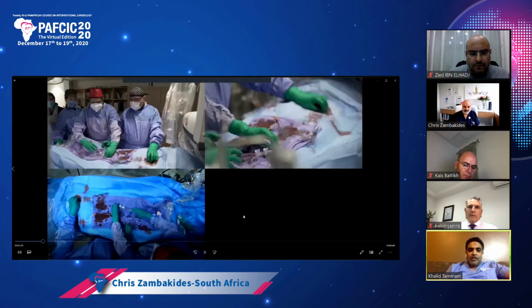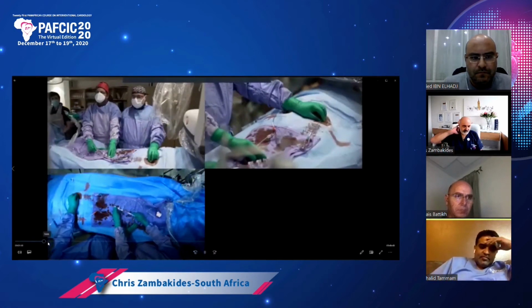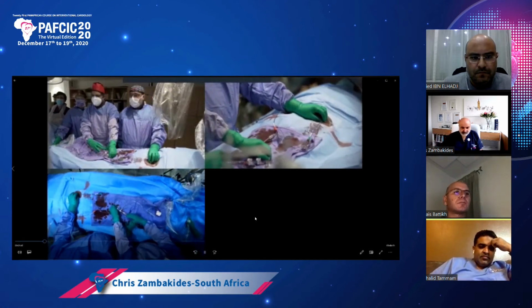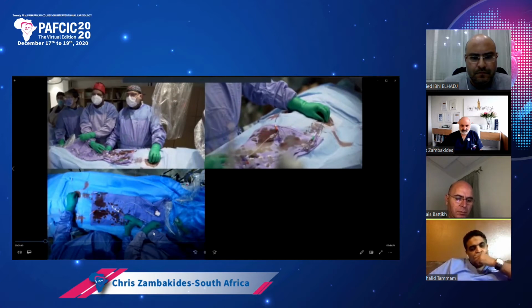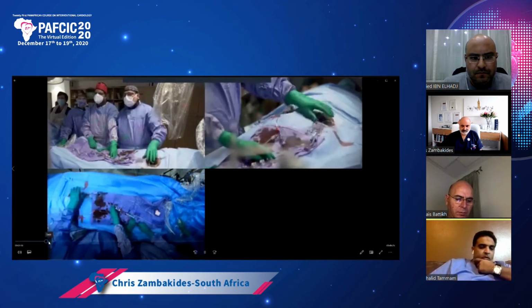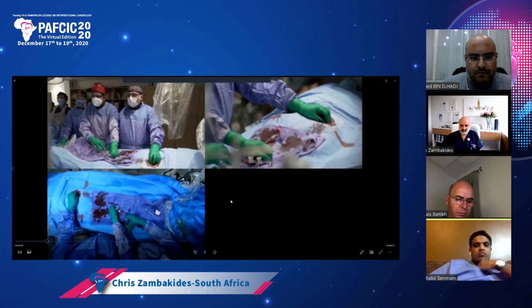No, okay, go ahead. That's right. So, okay, first let's do an LAO cranial. Okay, all right, so it's got to be off mag, and just go a little bit more, no, 1 mag more is fine. Yeah, just move the table a bit so that we get the right coronary artery fully in. Okay, all right, so Isabel, you're going to go first, and then Riaz will follow. Okay, go. And Riaz.